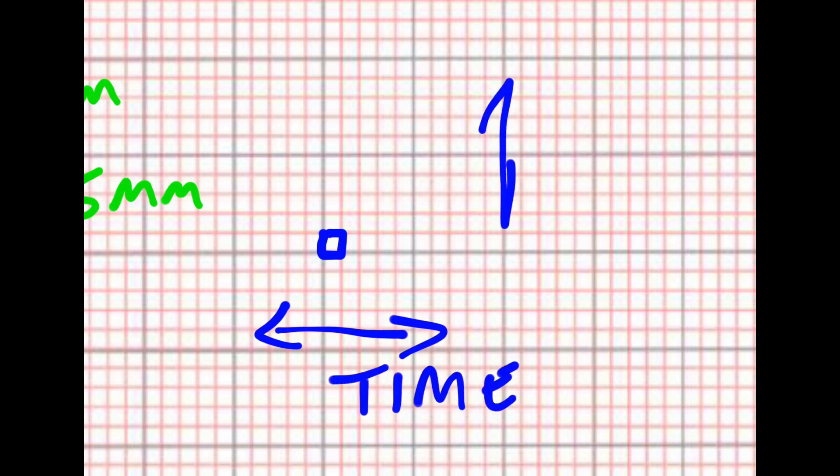One small box is one of those small boxes. When you're looking at an EKG paper from left to right, you're talking about time. When you're looking up and down, you're talking about voltage.